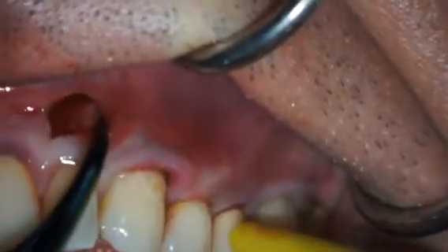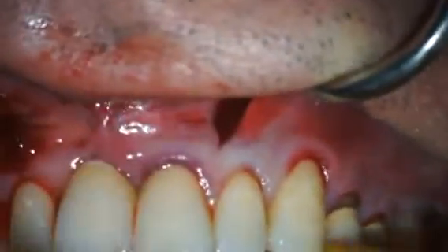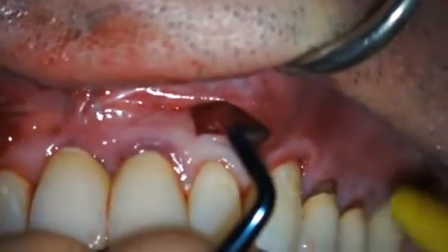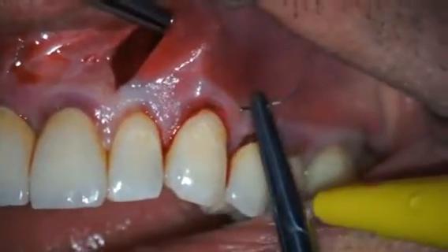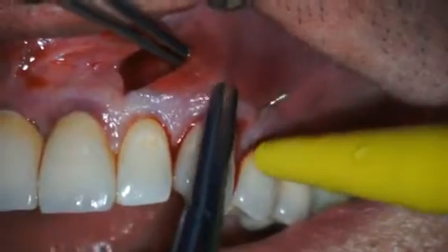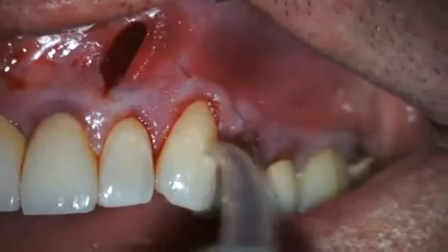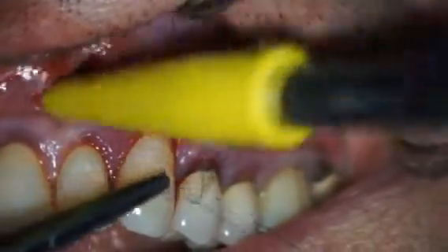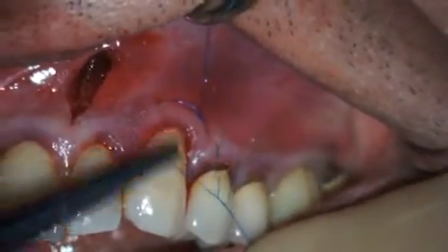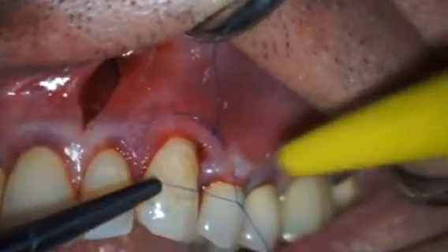Papillary reflection extends to the papilla distal to the most distally treated tooth. While making no surface incisions, the entire mucoperiosteal complex of each papilla is elevated away from the underlying bone. At each treated tooth, a 6-0 polypropylene horizontal mattress suture on a C3 needle is placed approximately 2 to 3 millimeters apical to the gingival margin, spanning close to the width of the tooth. If possible, place the suture within the zone of the keratinized tissue. The suture is tied loosely so that the knot can be positioned at the mid-coronal area of each tooth.